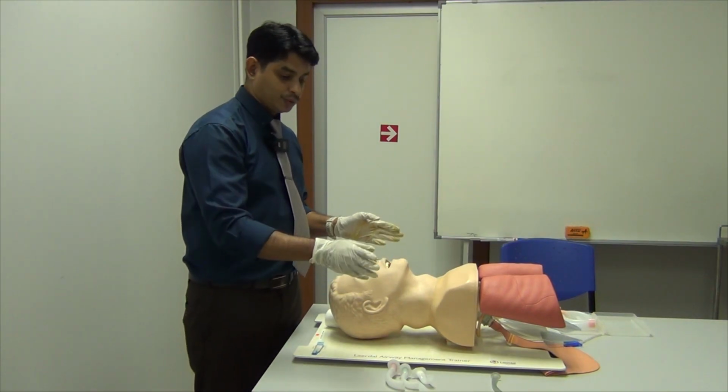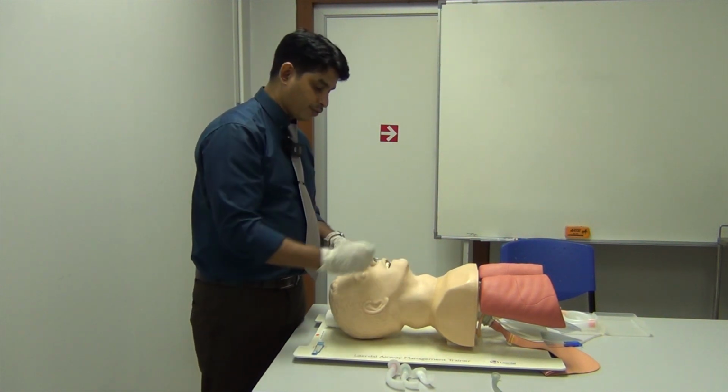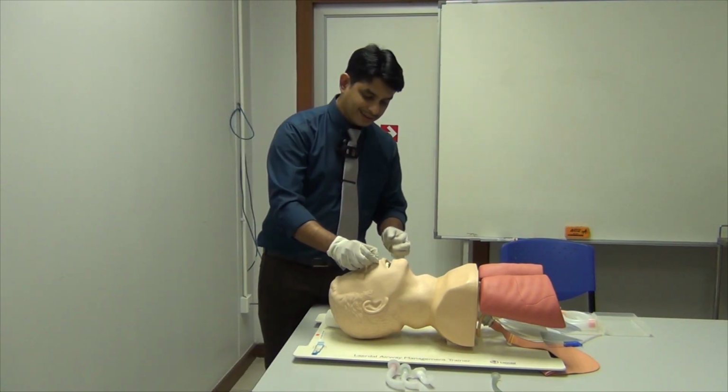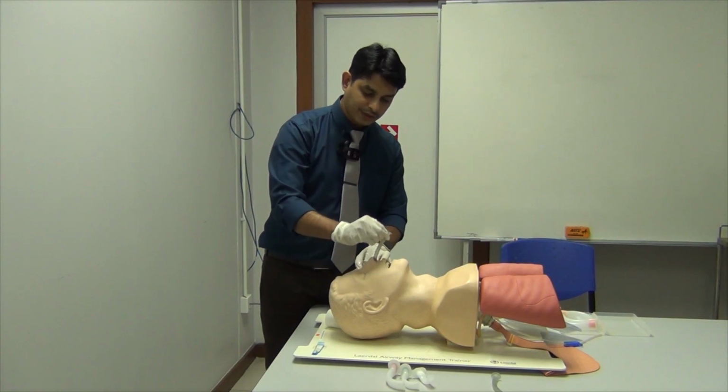So here two things: the nasopharyngeal airway and the oropharyngeal airway. Regarding the removal, it is easy to remove. You can remove it in the same curvature as you introduced it.